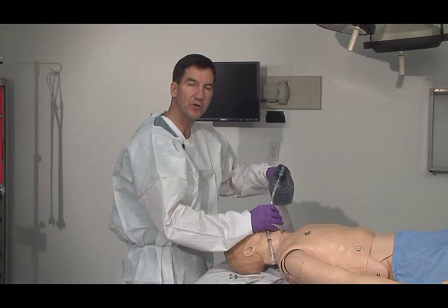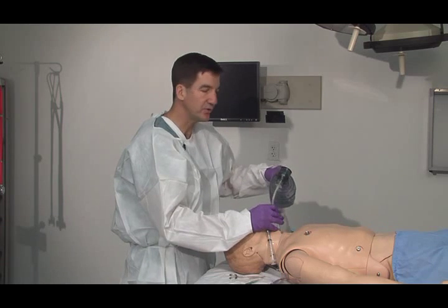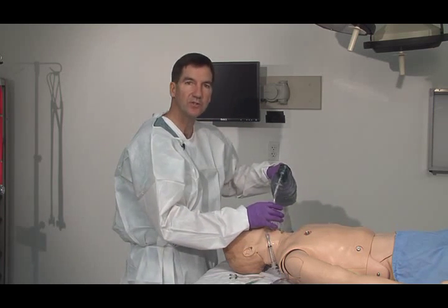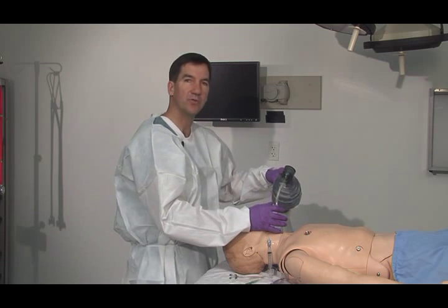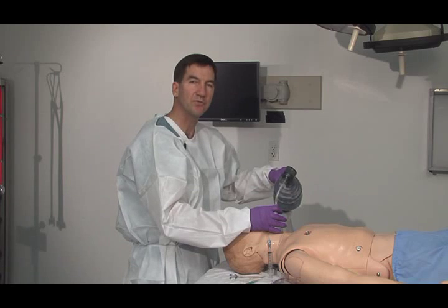You'll have the same criteria to watch for successful intubation. You want to see rise and fall of the chest, then auscultate both sides as well. Then you'll want to try some of your other devices to confirm placement.